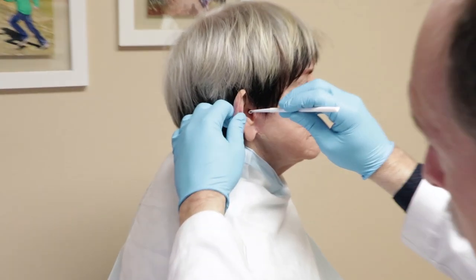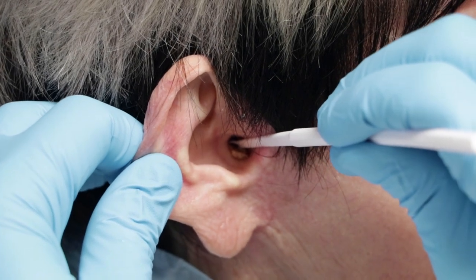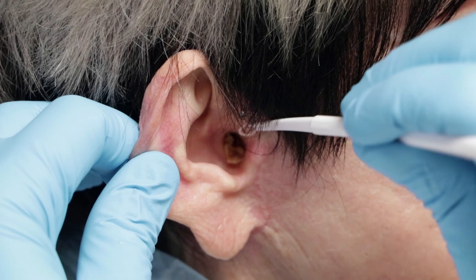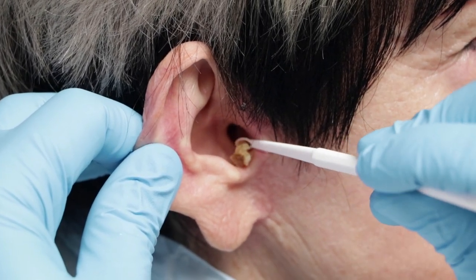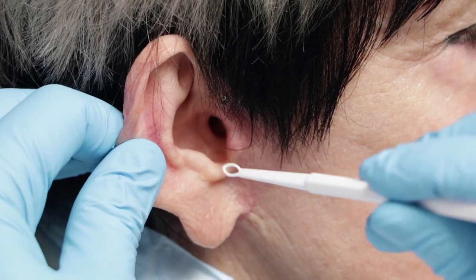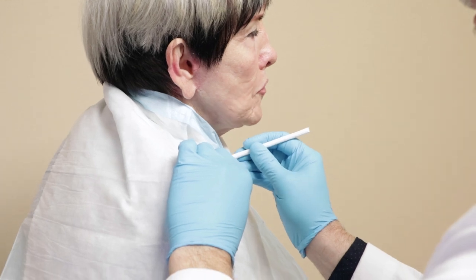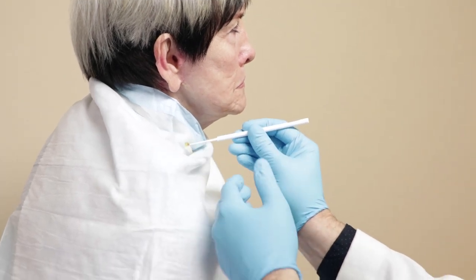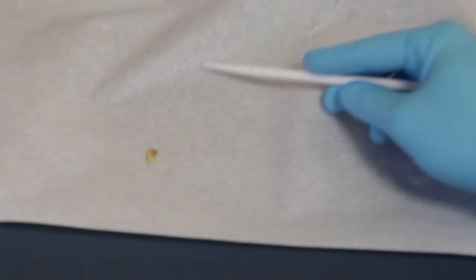All right, you okay there, Ian? So we've got this — you don't want to see it, do you? Okay to see it or not to see it? Oh yeah, that was a big chunk. Yeah, see we're doing something here. I already feel unclogged!